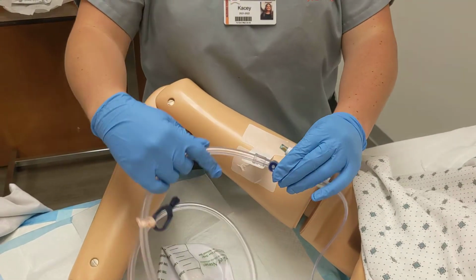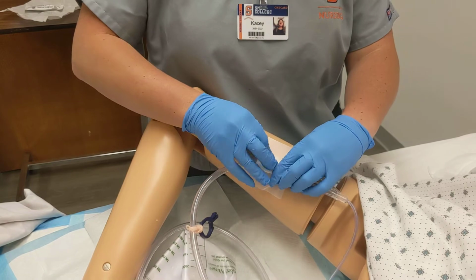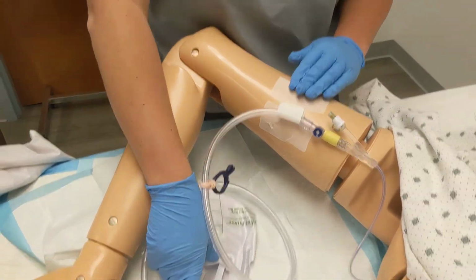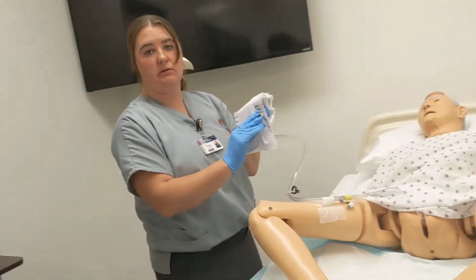And we'll just take this. Place it right here. And then we will make sure that the catheter bag is closed.